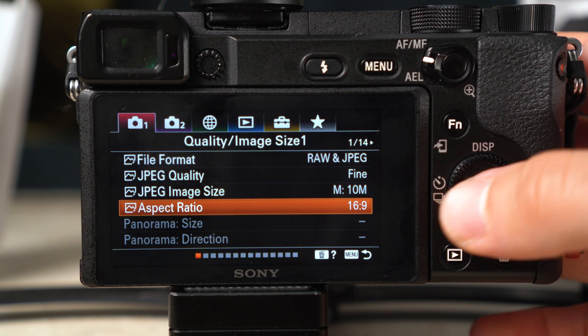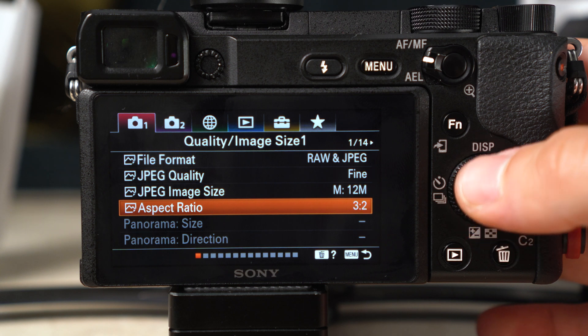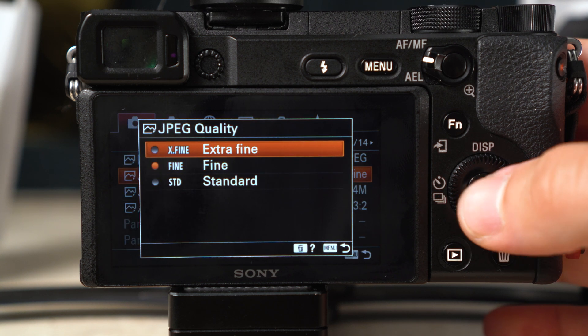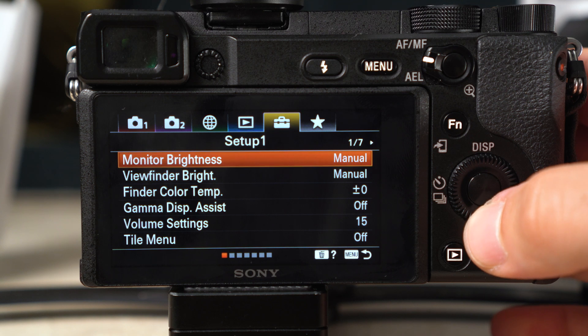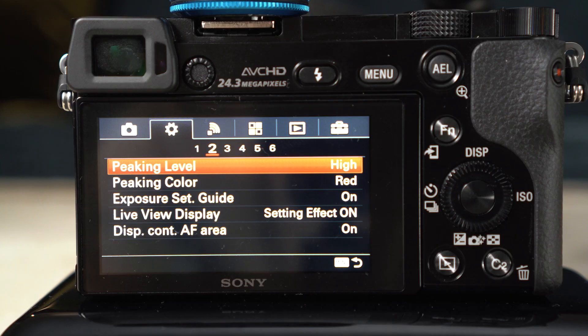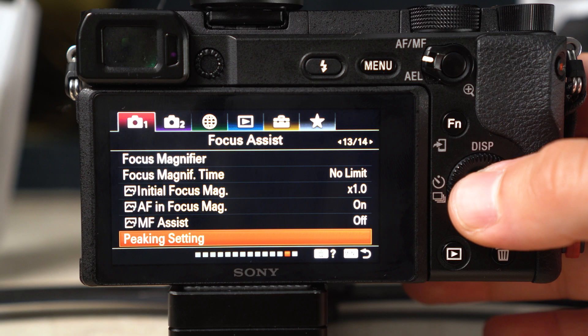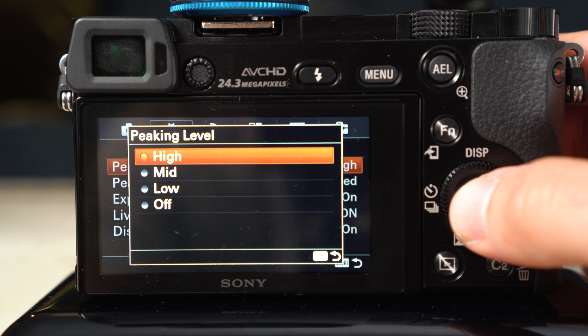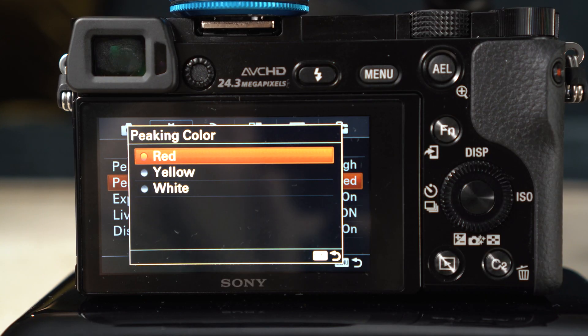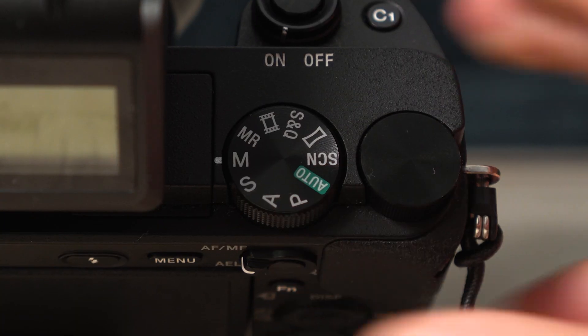Now for the actual camera settings. First, change the aspect ratio — on the first page of the first tab — to 3:2. This lets you change the image size to 24 megapixels. If you're on the a6400, also change the JPEG quality to Extra Fine. Next, change the monitor brightness, found in the briefcase menu tab, to Sunny Weather, which significantly brightens the monitor for focusing in dark areas of the mouth. Then go to focus peaking settings and set the peaking level to High for the Nissin ring flash, or Mid for the Meike twin flash. Set the color to red on the a6000, or blue on the a6400.